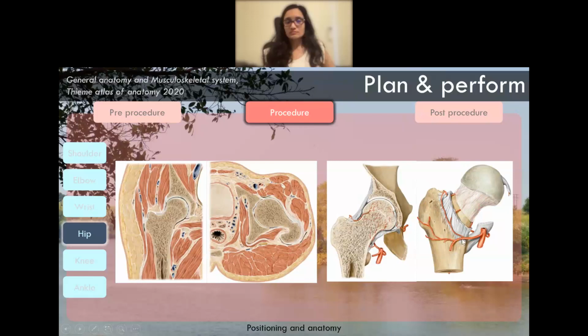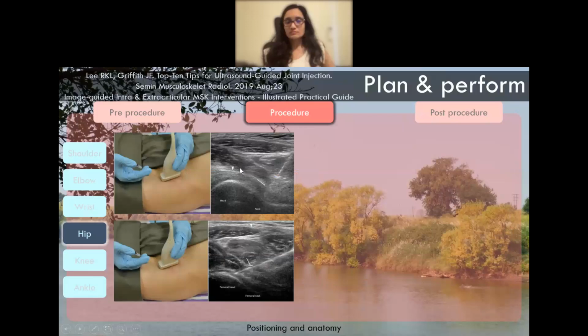While we are inserting the needle to reach this bare area, in some patients the vessels might have a very close course to the trajectory of the needle. We should be very careful regarding that. Usually the vessels will come at this place.